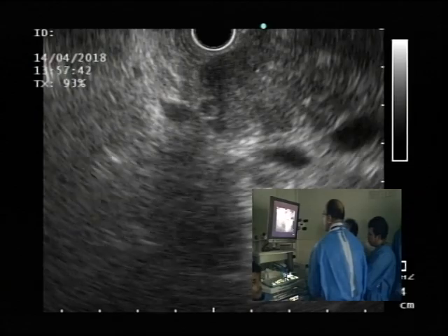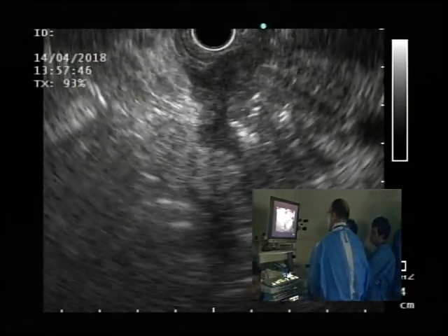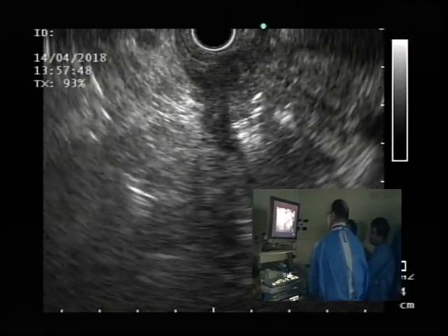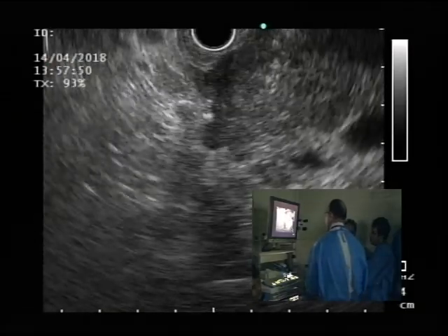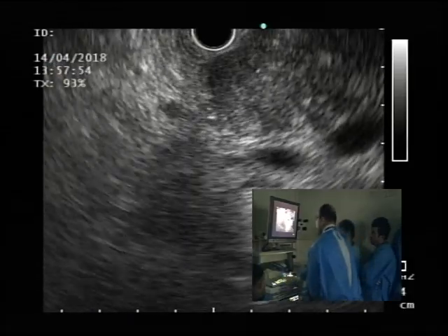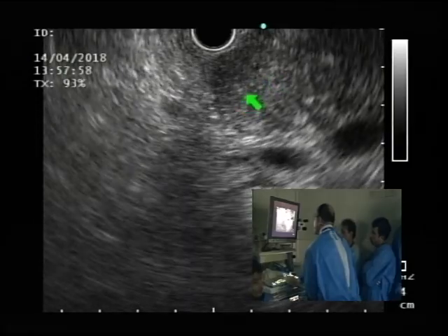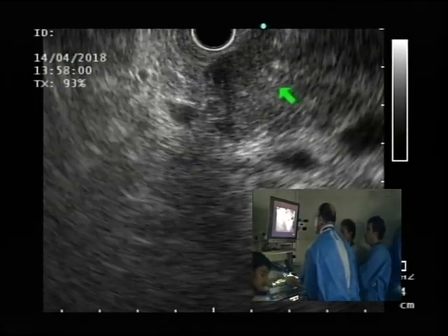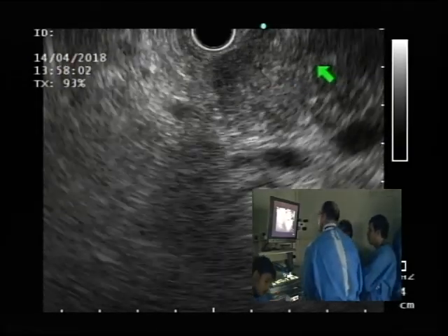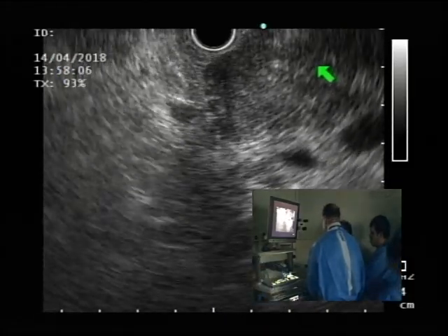So this is one area where, because I need a lot of thumb down flexion, I will actually lock my big wheel. And for sampling, if you can get the periphery is better because you'll have less necrosis. But what we're going to do is, I think this is a reasonably good position to get the lesion. You can see the tip of the needle.